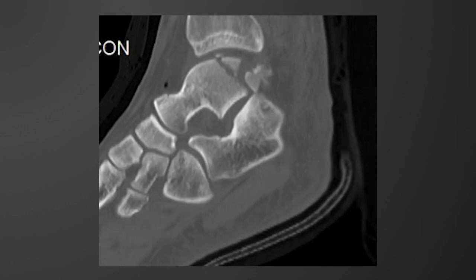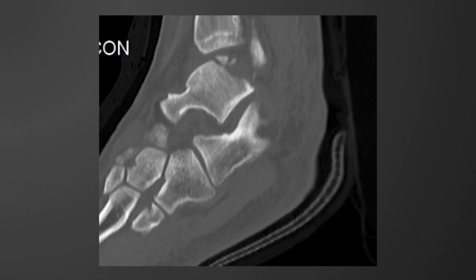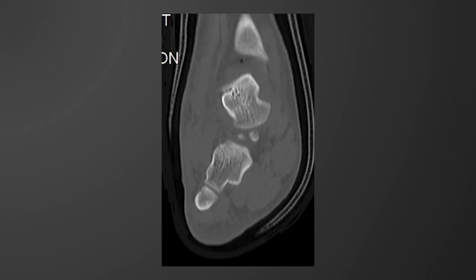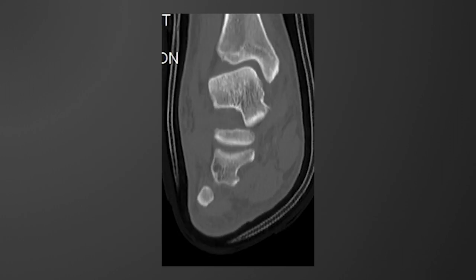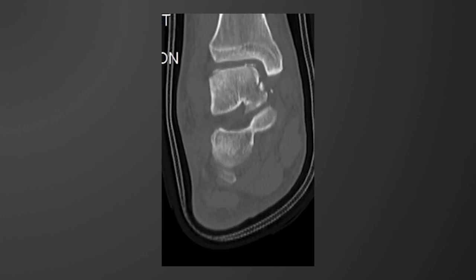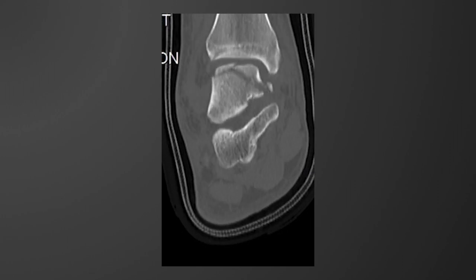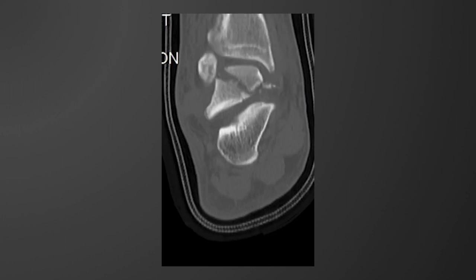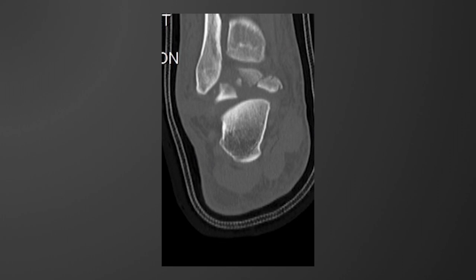You can see significant involvement of the articular surface of the tibiotalar joint, and in the coronal images we again see an intact neck of the talus with comminution from the mid talar body posteriorly, showing both medial and lateral displaced fragments.